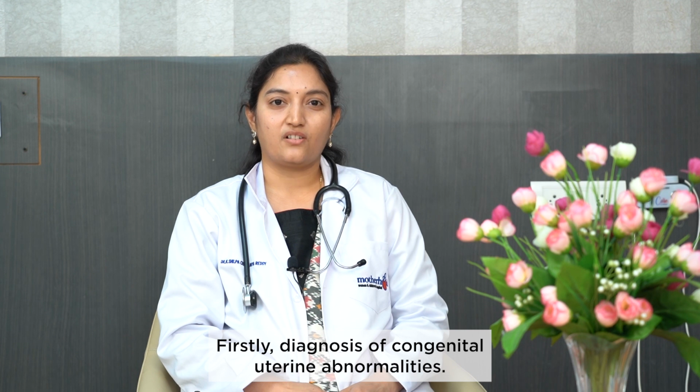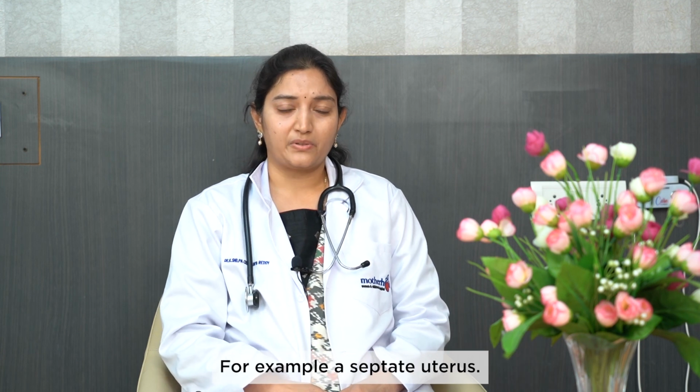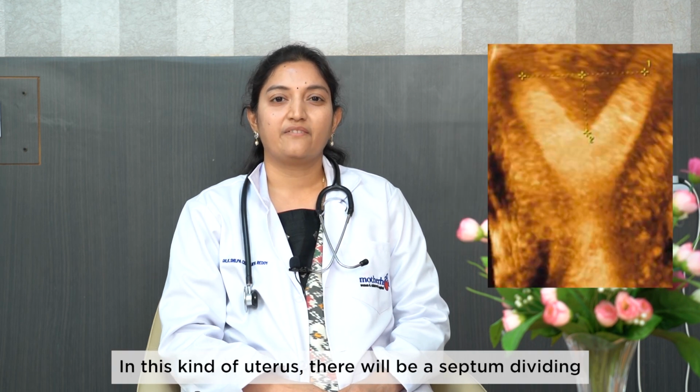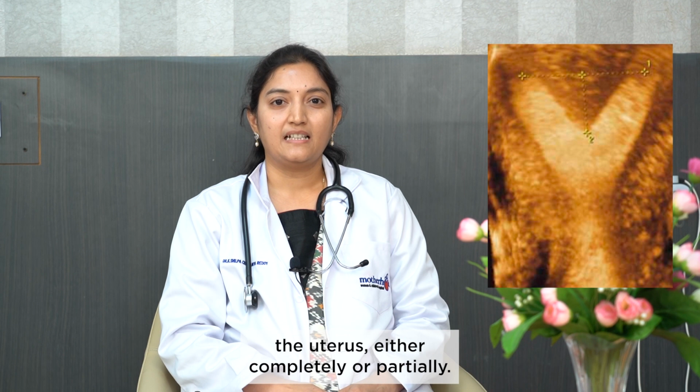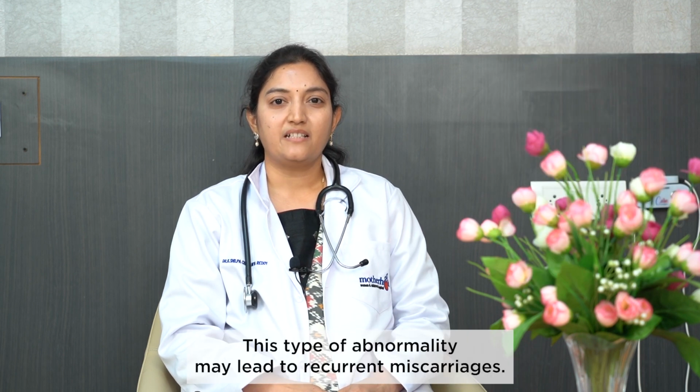Firstly, diagnosis of congenital uterine abnormalities. These are a spectrum of disorders where the uterine cavity and shape are abnormal. For example, a septate uterus. In this kind of uterus, there will be a septum dividing the uterus either completely or partially. This type of abnormality may lead to recurrent miscarriages.